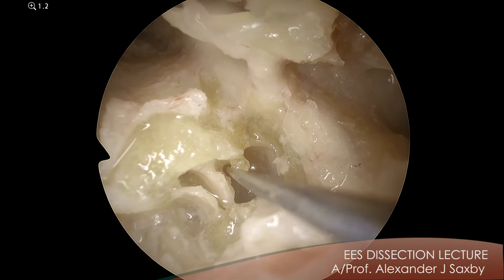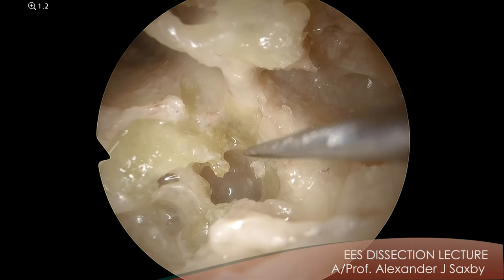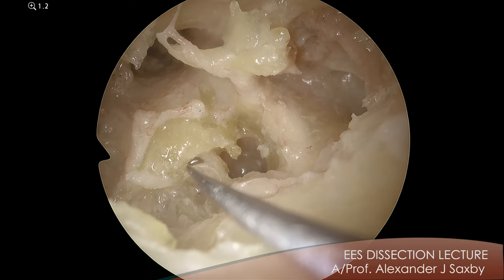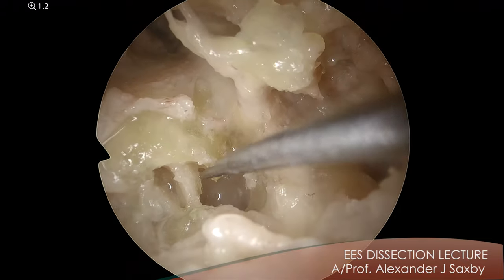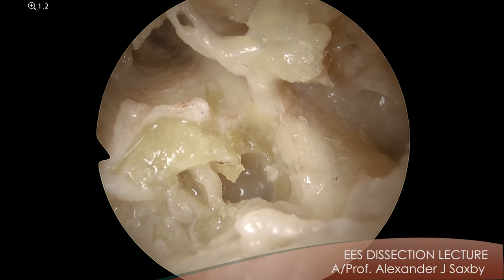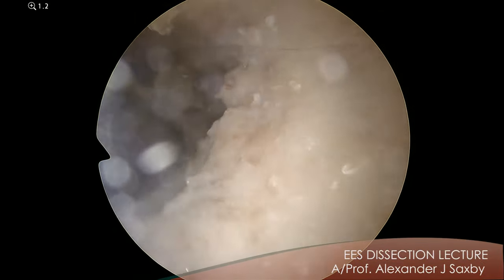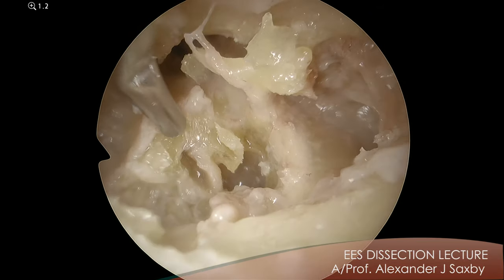I'm going to peel the round window membrane down, and you can see that enters the scala tympani, which is separated from the vestibule by this wall — the osseospiral lamina with the basilar membrane coming off it. So above the osseospiral lamina will be the scala vestibuli, and that opens into the vestibule where the cochlear duct is. Sound waves pressing on the stapes send pressure waves through the scala vestibuli, up and around the cochlea to the helicotrema, down the scala tympani, and then out of this window here. I think seeing it with your endoscope will make this the clearest it's ever been. So I'm going to curette just this part here and you'll see the classic view of the cochlea.